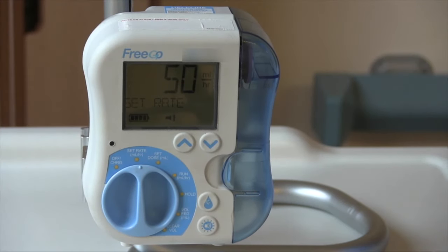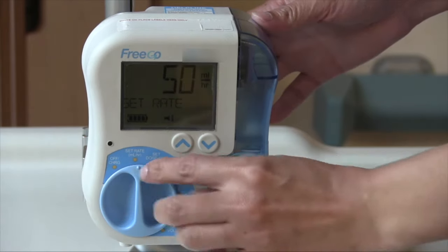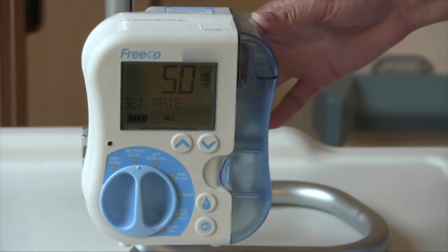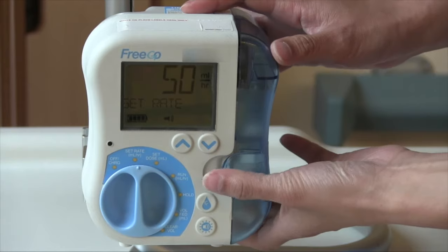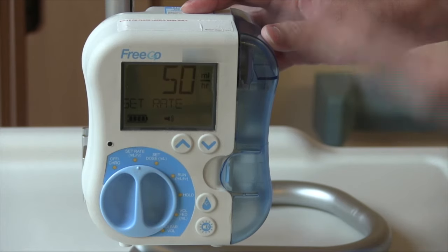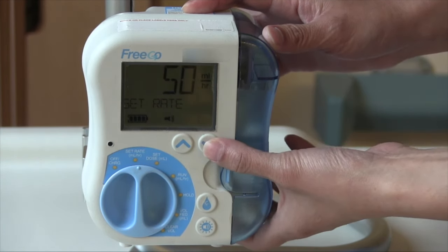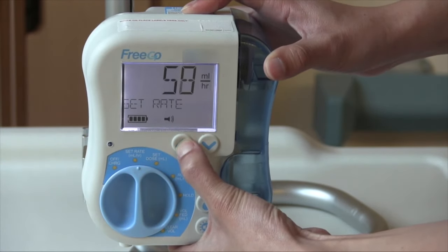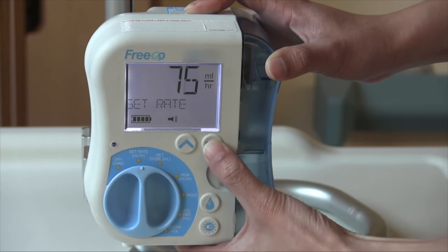Now we will go over how to program your pump. After you have primed your giving set, which means to push all the air out of the giving set tube, you can set your rate. Your dial will already be turned to set rate as you've turned on your machine. The dietician will give you a regimen that will specify the rate for the individual — the rate is how fast you will be getting your feed. In this training video example, we will set the rate at 75 mils an hour, meaning in one hour you will receive 75 mils of feed. To change the number, locate the up and down arrows on the pump. Press the up arrow to increase and the down arrow to decrease. Press and hold the up arrow to reach 75. If you pass the number, press the down arrow to adjust. We have now set the rate.